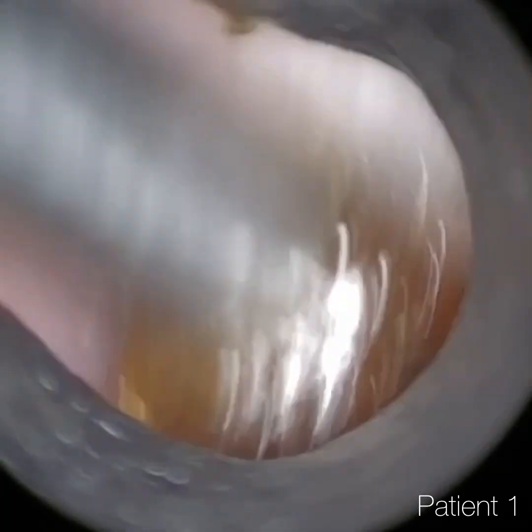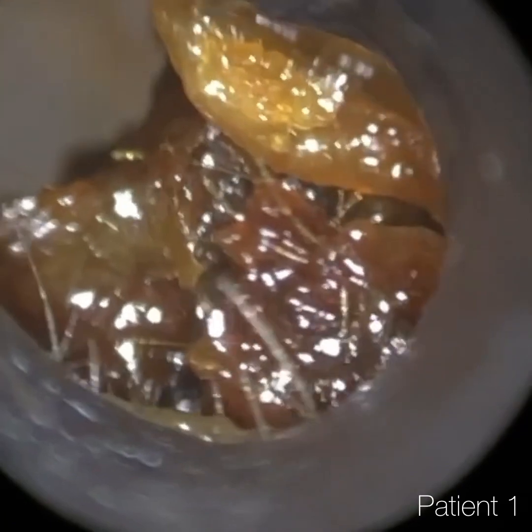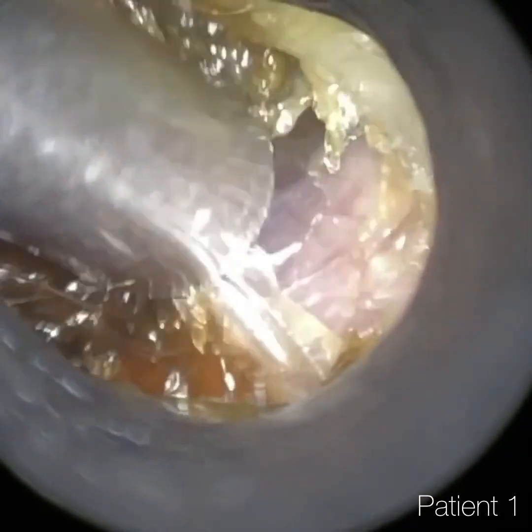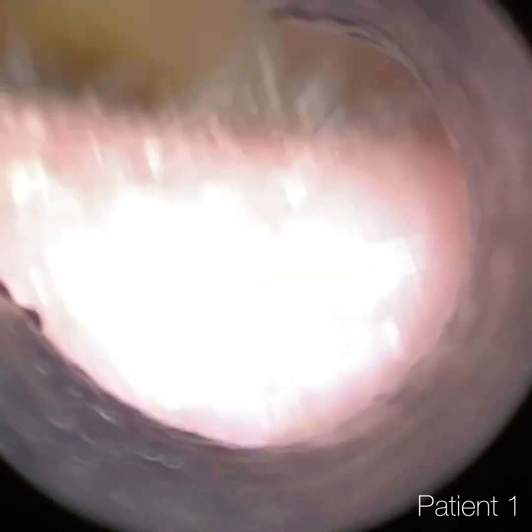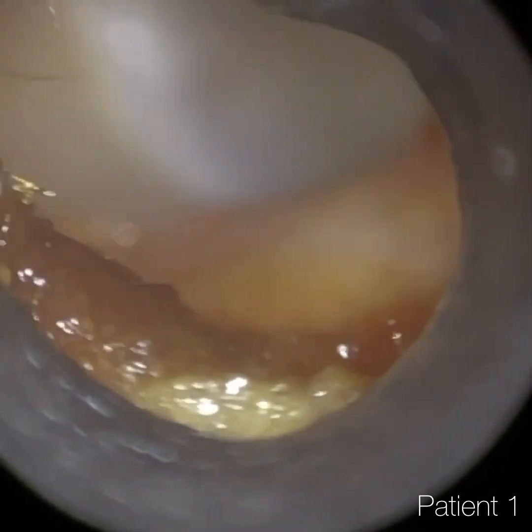So we're just using the speculum to expand the ear canal. Primarily, these videos are designed for healthcare professionals, but of course, if you're a Facebook or YouTube follower, you're more than welcome to enjoy and watch these videos. I know some prefer the endoscopic view, so I'm always uploading videos with the endoscope — the iClearScope — as well.